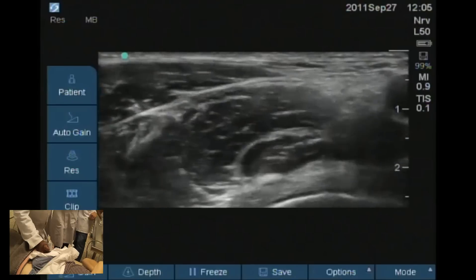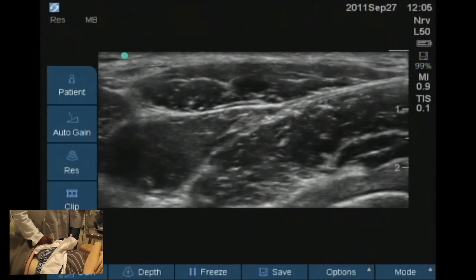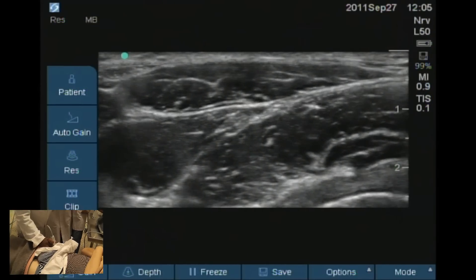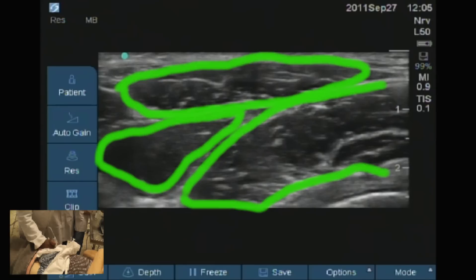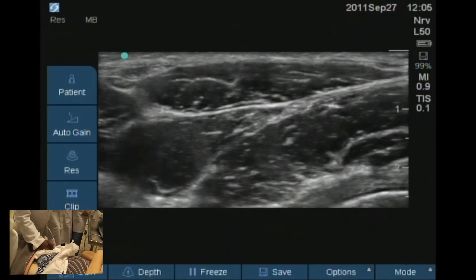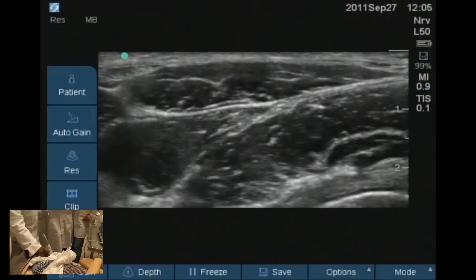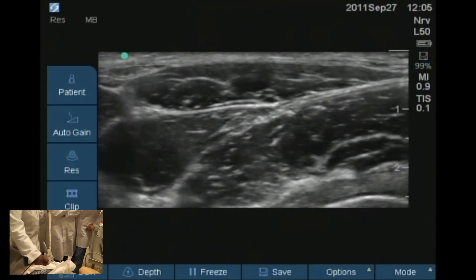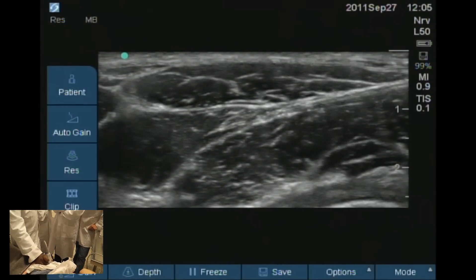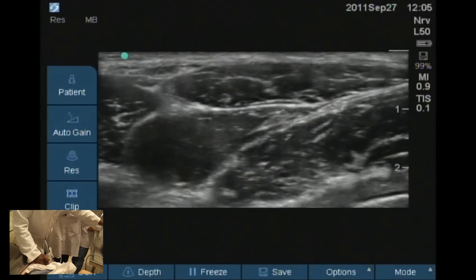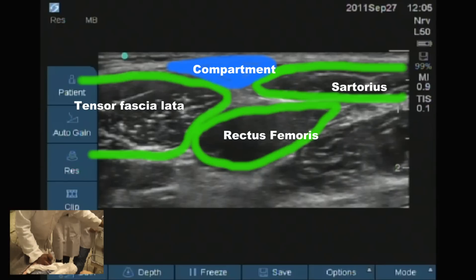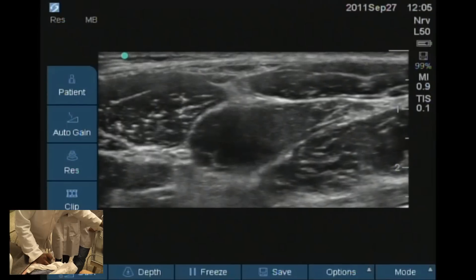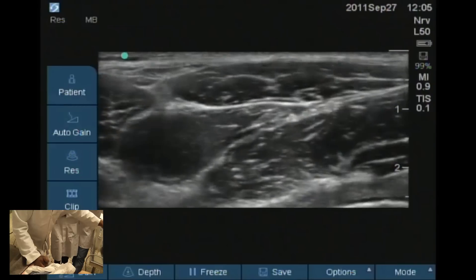So if you look for the lateral cutaneous nerve at the same level — if you move your probe laterally, then you see the iliacus muscle. That's your fascia iliaca. It's called the spade-shape appearance there. And above that you'll see a small little compartment — this is the compartment through which the lateral cutaneous nerve passes. You saw the sartorius and there is a small tunnel above the sartorius in which the lateral cutaneous nerve layer was covered. So basically this is the tunnel — it is between the sartorius and the tensor fascia lata. There is a small gap in between the tunnels there, but you can have a tunnel above the sartorius as well.